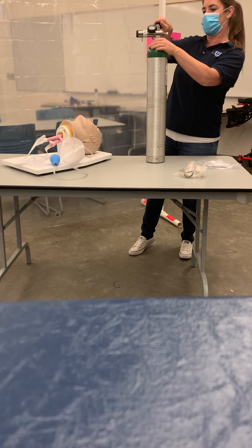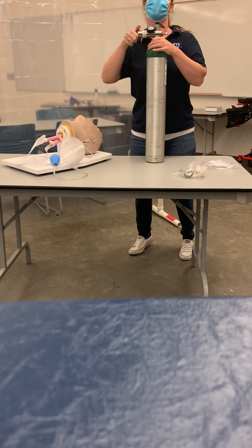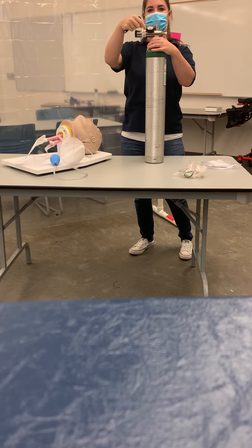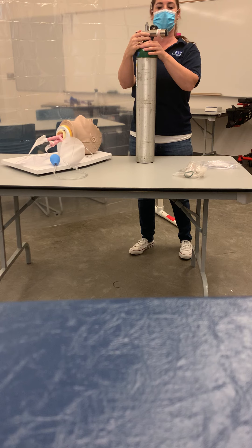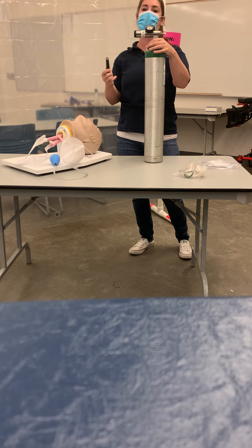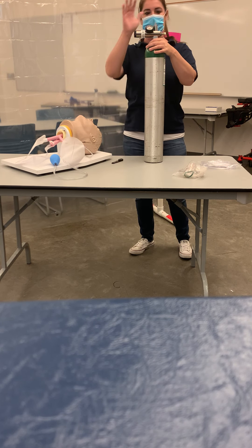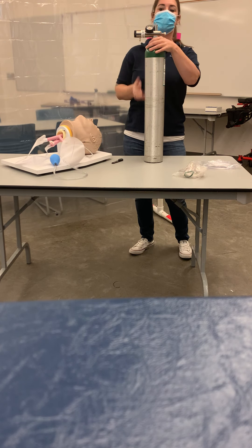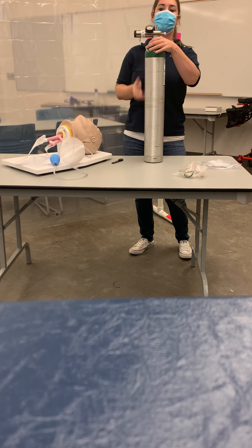The first thing we're going to do is get our oxygen key, hold onto our tank, and crack it to clear any debris. Just real quick — it doesn't have to be long, we just want to clear any debris. Next, select your regulator and put it on the O2 tank. You'll see that these line up perfectly, so I'll turn it around so I can see it. There we go.